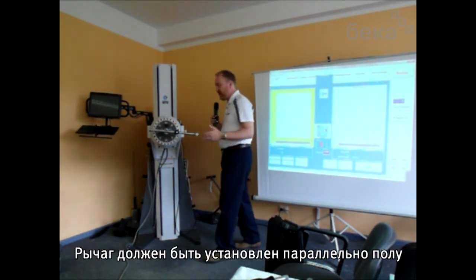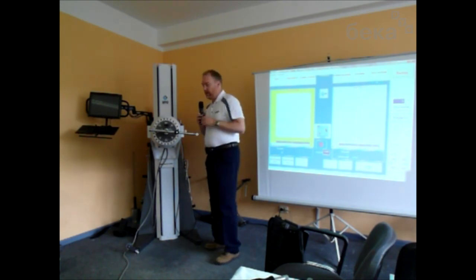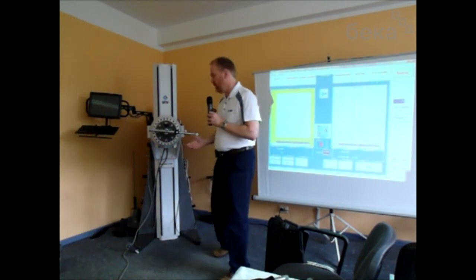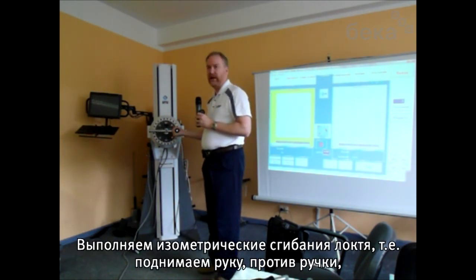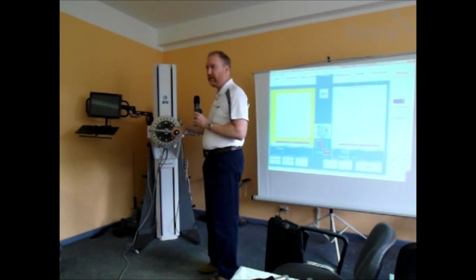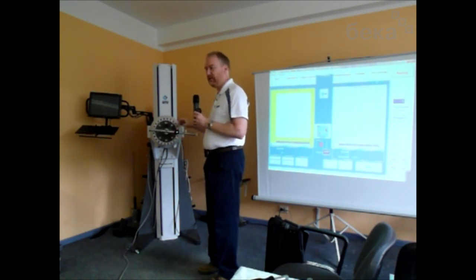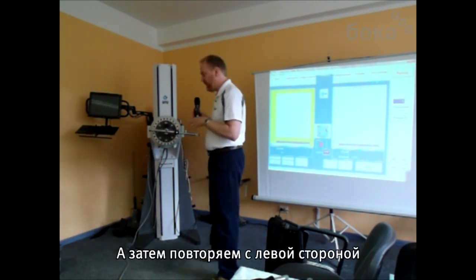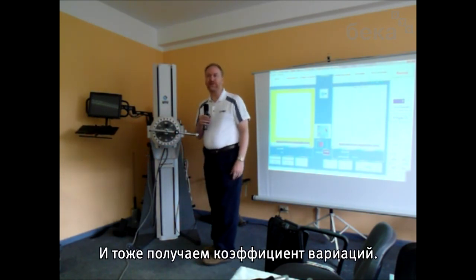So set up this attachment so that the bar is parallel to the floor. And you'll start with the right hand, doing isometric elbow flexion. So they're pulling up against the handle. And then they place their hand on top, so they're changing hand position, and then pushing down against the handle. So then you alternate pull up, flexion, extension, flexion, extension, flexion, extension. And then repeat left side. That gives you 4 more coefficient variations.